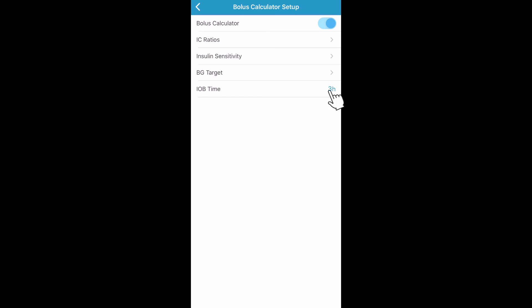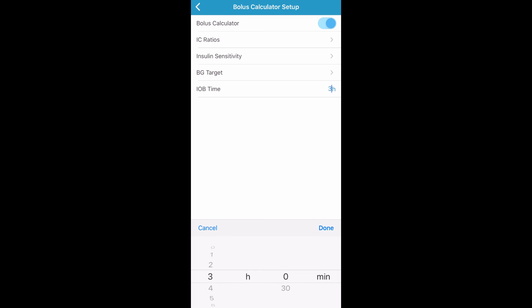Now you can set up your insulin on board time for your pump by tapping on IOB Time. You can adjust the insulin on board time by changing the time. Now tap Done. The bolus calculator is now set up and ready to use.